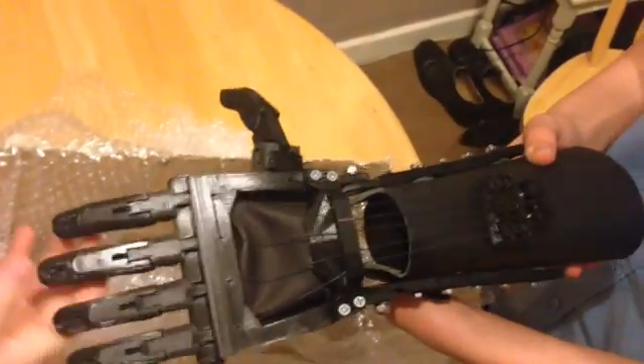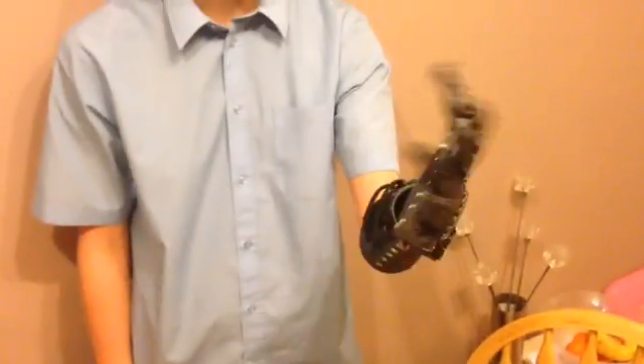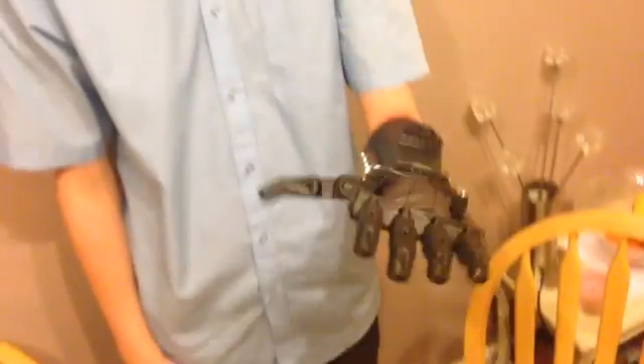We'll put that on. Here it is — look, there you go. I think it might need a little tightening. Look at that. That's bizarre, isn't it? It looks great. It's all Jack and Joe so far. Very good.